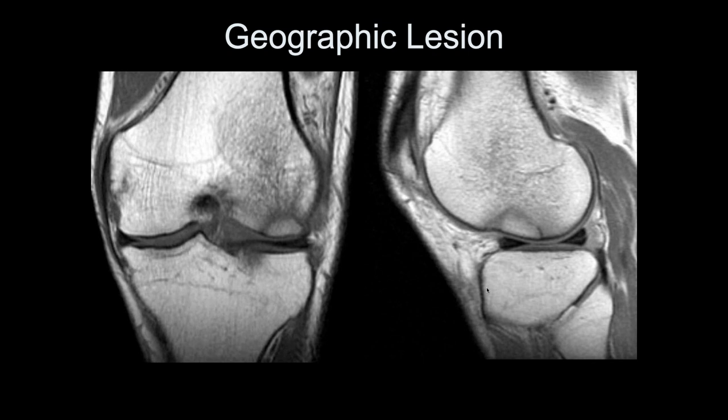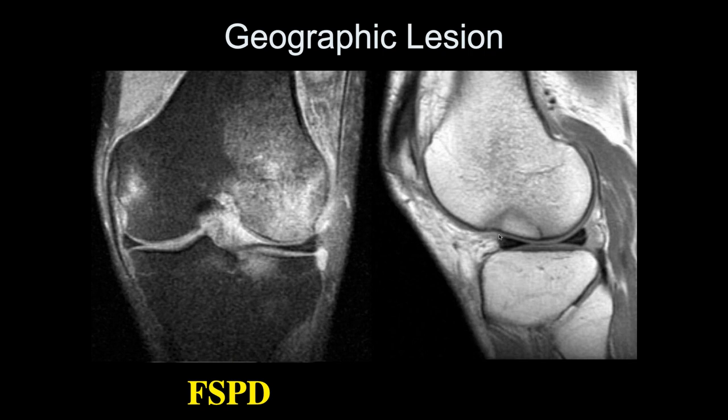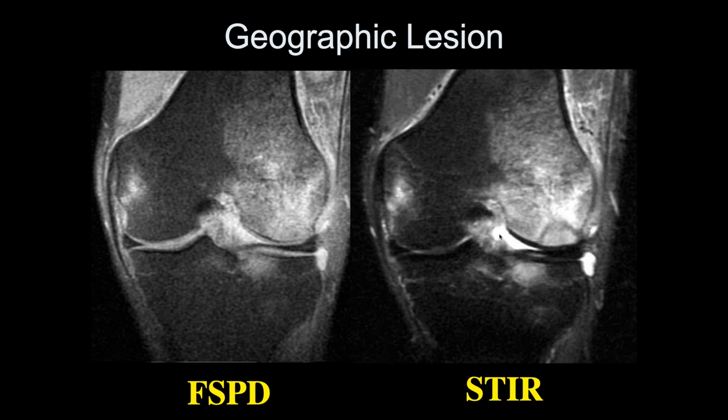So here we see a similar one. We see this curvilinear low signal intensity in the subchondral bone. And there's impaction, but the overlying cartilage is probably still intact, though there's quite a bit of edema within that little injury and the surrounding bone. But it doesn't look like there's fluid within the fracture line itself. So just call it a subchondral fracture at this point.